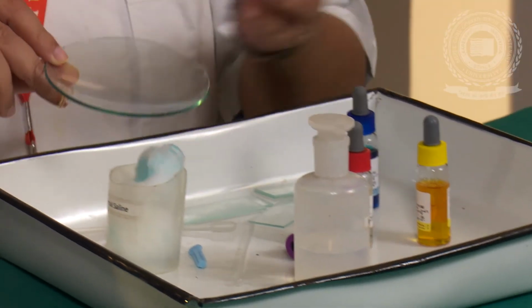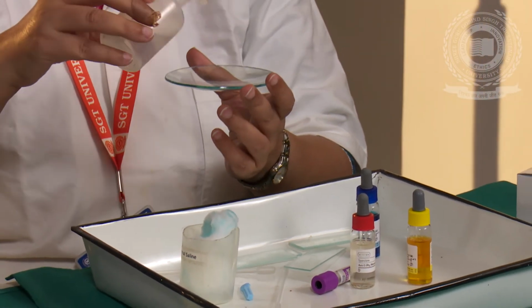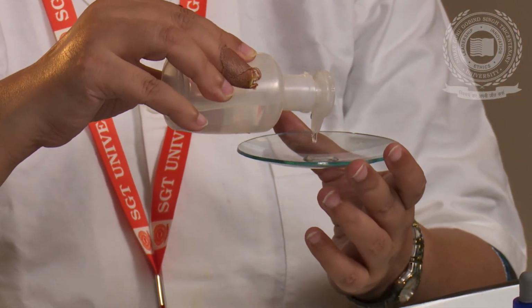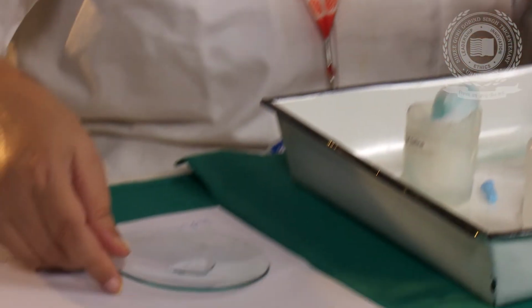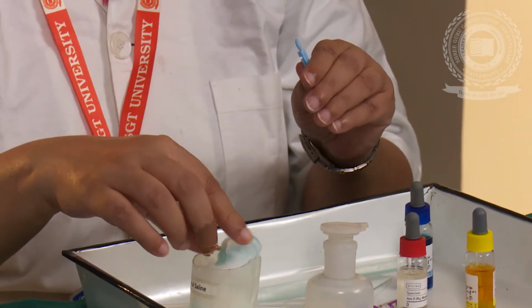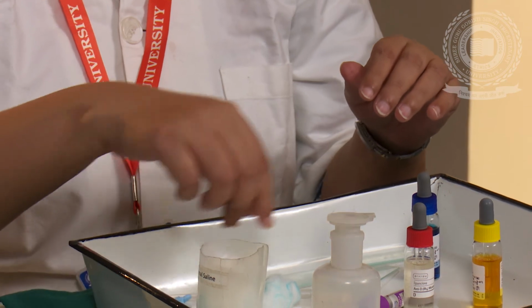The very first step is taking normal saline in the watch glass like this, 2 to 3 ml. Then the student proceeds to take a finger prick with the help of a lancet and spirit swab using complete aseptic precautions.